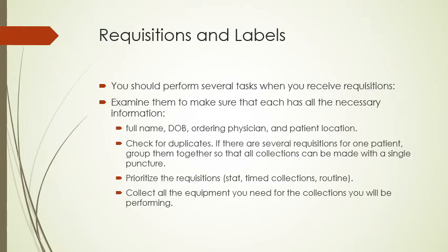When you see a requisition or receive a computer printed label, whichever one you get, first you want to examine it and make sure that it has all the necessary information. Once again, it has that full name, date of birth, ordering physician, and patient location.